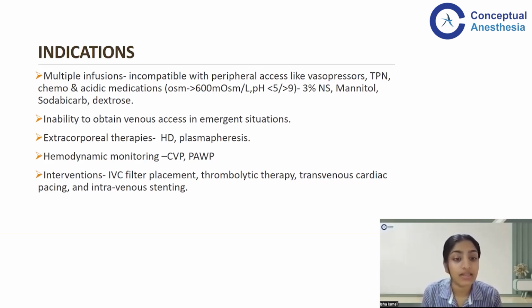all of these will necessitate a central venous access. Also, in emergency situations, when you're not able to get a venous access, your patient is dehydrated, the patient is pediatric, the patient is a burns patient, something like that, you will require a venous access immediately, and a central venous access could be helpful in such situations.